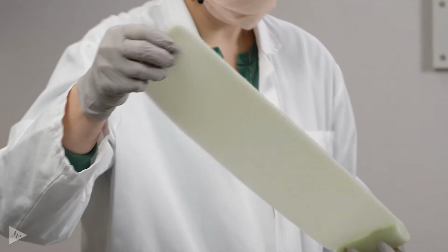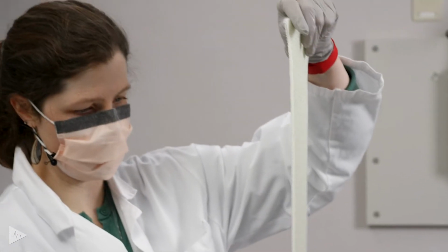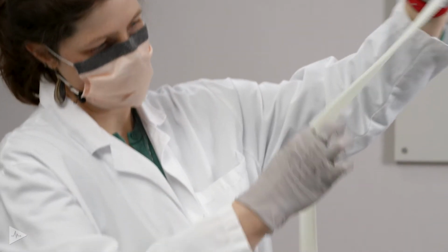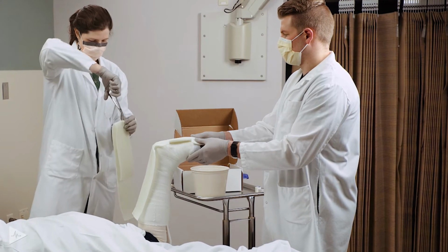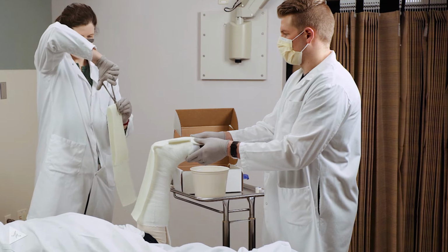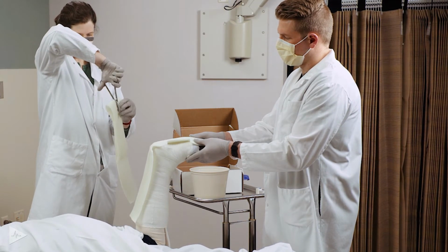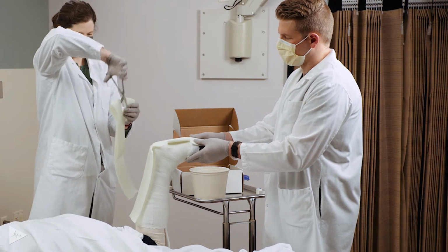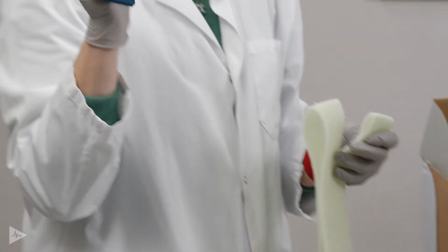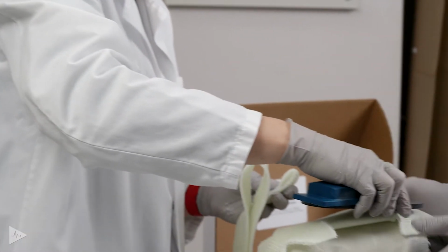We will then have another splint layer. So this will be identical to the first. I'll roll that out. Usually try to look about 2/3. Fold that back. And we're going to trim an opening for the peg. As you do this more and more, you'll get an idea of how much you need to fold and where you need to trim that back. I usually will go down about 3.5 inches. So we have both a strike plate, which is the dark piece, and that will go down first.